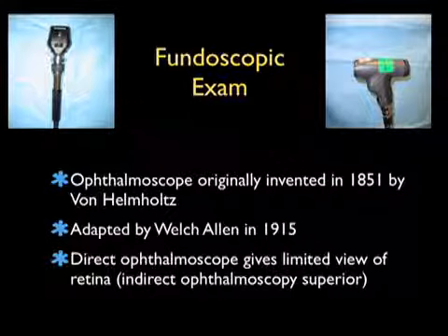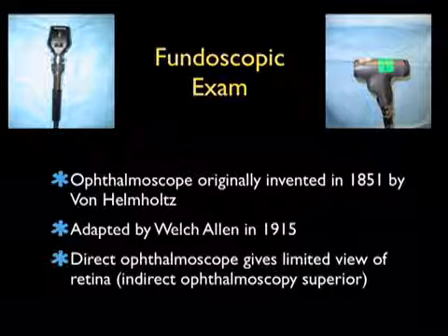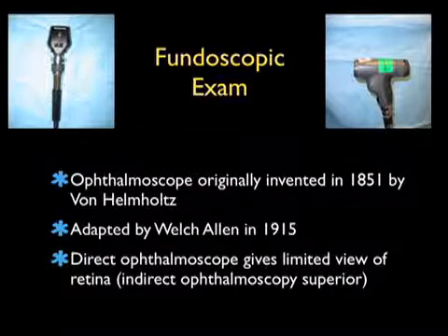However, it's well understood by ophthalmologists that direct ophthalmoscopy gives a limited view of the retina in comparison to the techniques that they'll use on examination of the retina, which is indirect ophthalmoscopy using a mirror and curved lens.